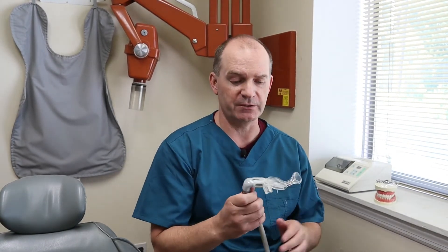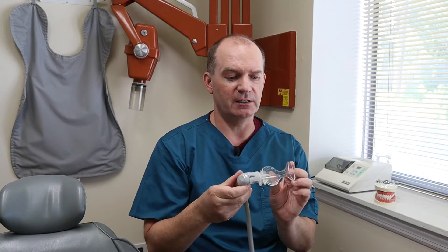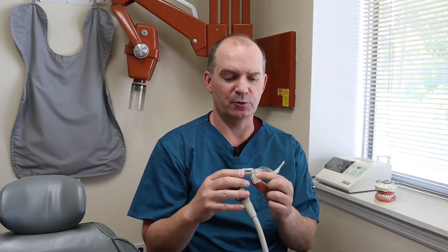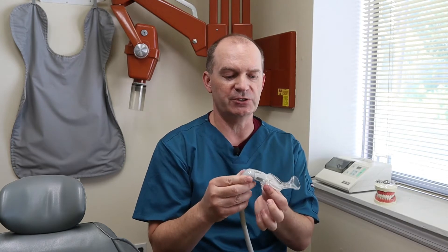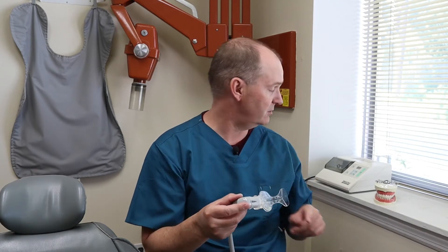We also have a third suction option called the Isolite, or the Iso-Dry. This one's kind of a specialty all-in-one device. It's got a little bite block you can bite down on, rest your teeth on, rest your jaw so you don't have to hold your jaw open the entire time you're getting worked on. And it bends around the teeth, so it's got a section that keeps your tongue away from the tooth, and then a section that keeps your cheek away from the tooth.